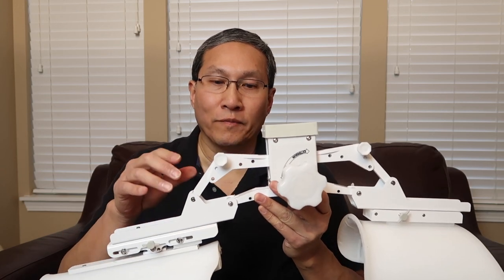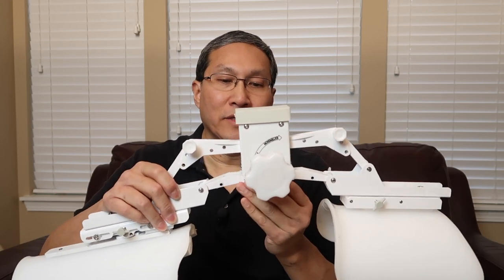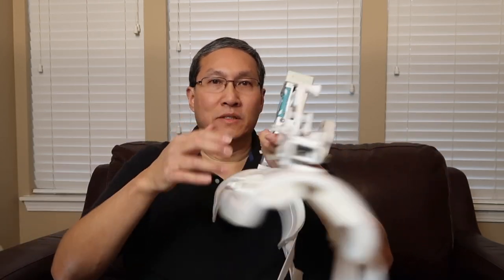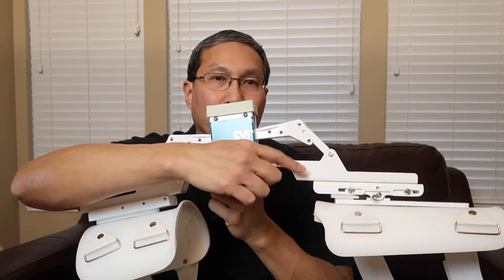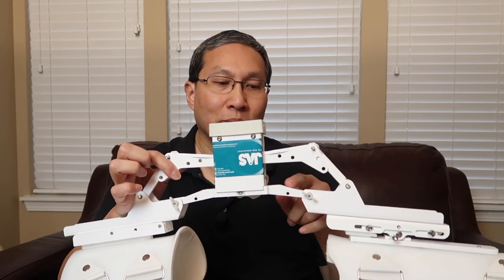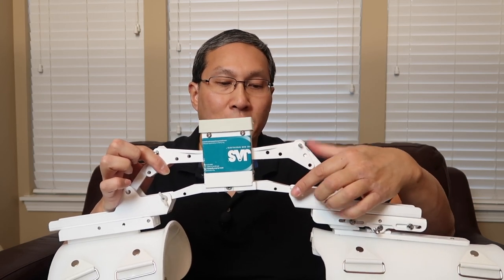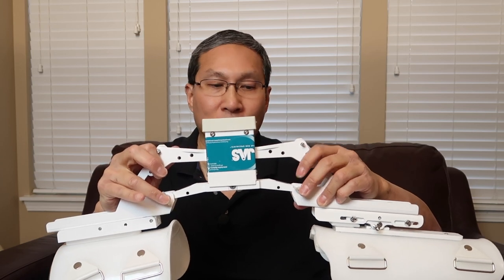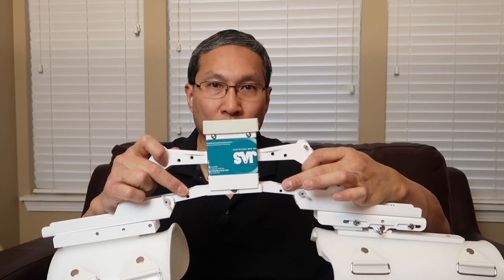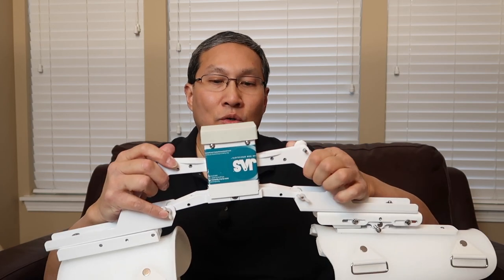If you have a unit like this, it can go from flexion to extension. Right now you can see it's in the extension mode. There is a narrow section and a wide section. If you look here, you'll see a couple of wing nuts. There are two holes in this section and two in this one. If your unit came in the wide setting, they would be on the furthest holes. If your unit came in narrow, they would be on the narrow holes. We're going to talk about the wide version right now.